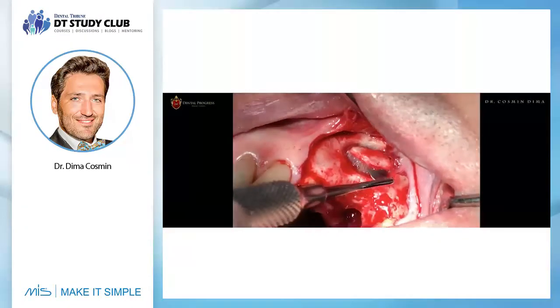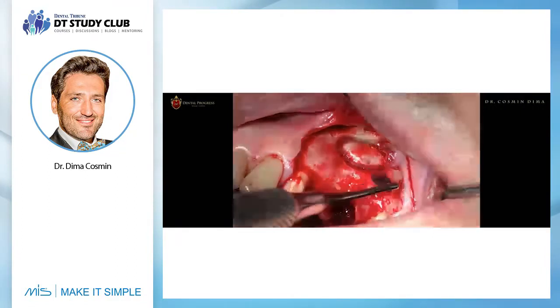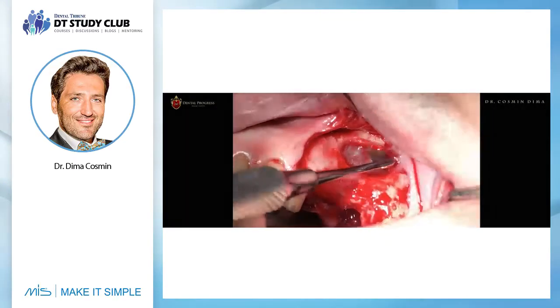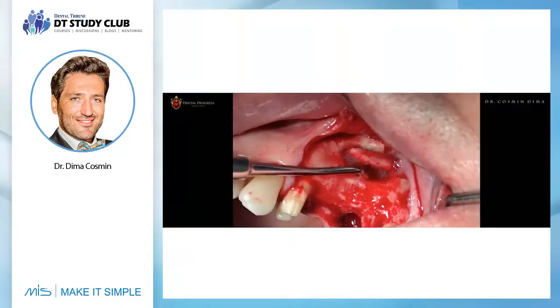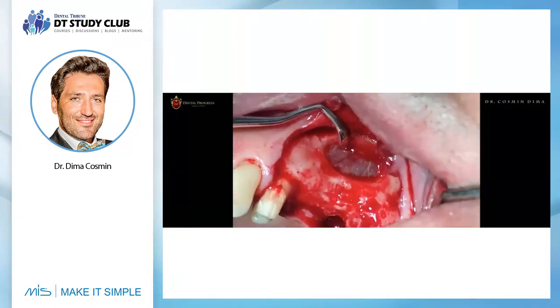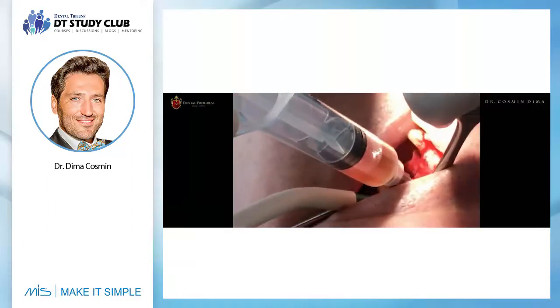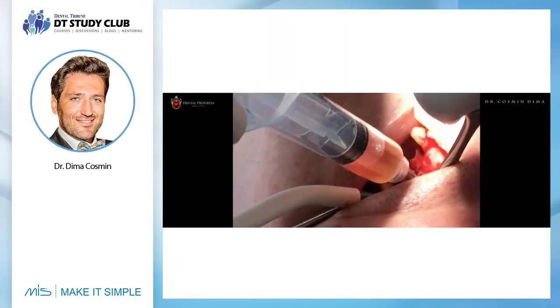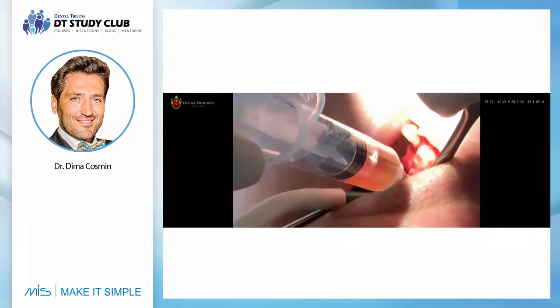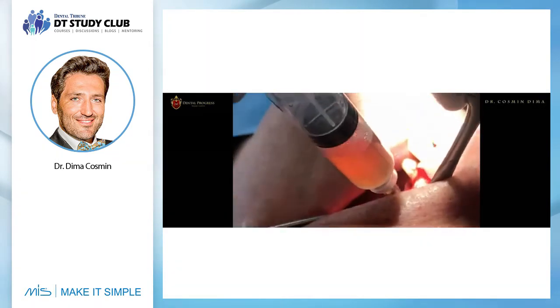Try to detach the bony window very gently from the Schneiderian membrane, like you can see here. You can see how much liquid was inside the cyst.